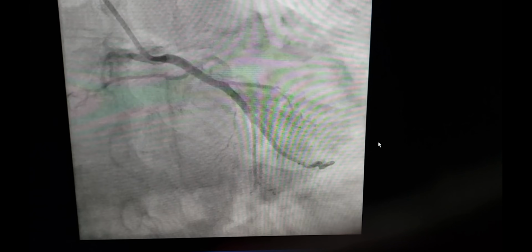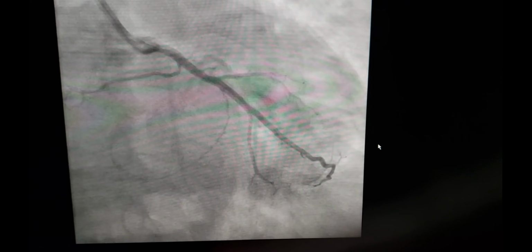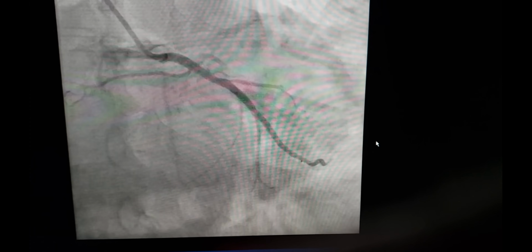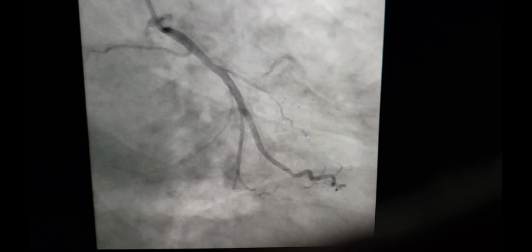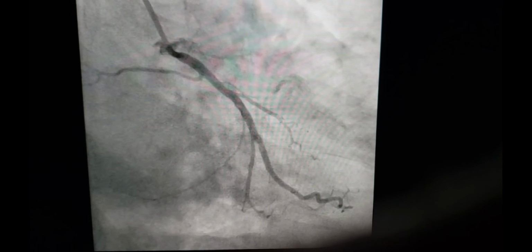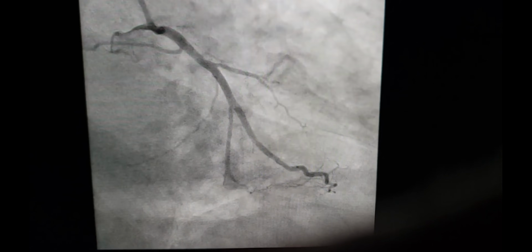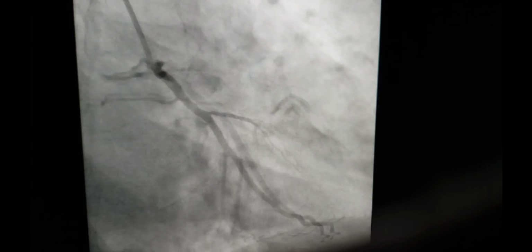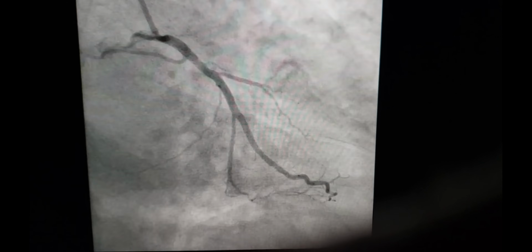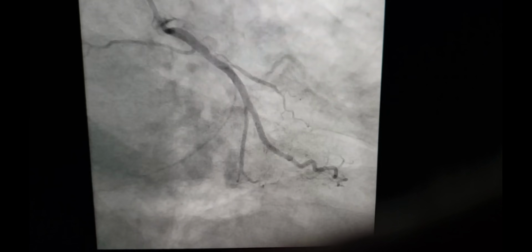We eventually also took this TIG catheter and dipped it into the left ventricle, and of course you can inject dye with either a hand injection or an injector, power injector, or just take pressures and check the gradient across the aortic valve and get out. That will count as a cardiac cath as long as you dip into the LV. We do all of these radially, and the less equipment you use, the better. So using something like a TIG catheter where you can just do the whole thing with one catheter is obviously much better. So that's all for the images.